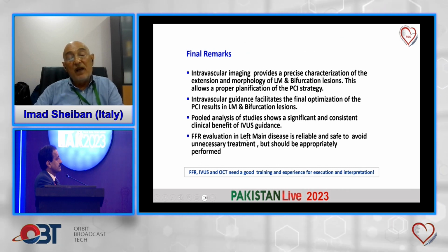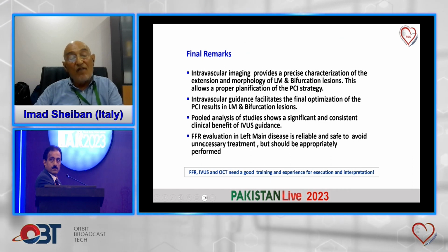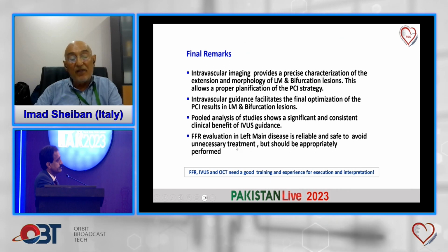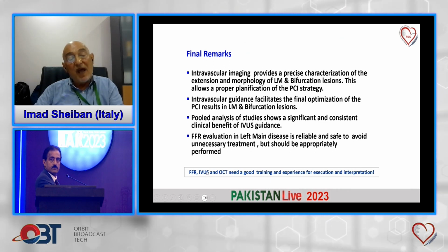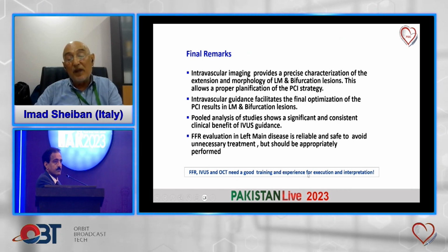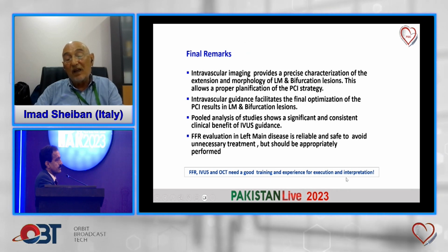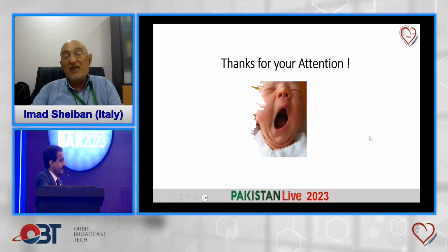FFR evaluation in left main disease is reliable and safe to avoid unnecessary treatment, but should be appropriately performed. I think both physiology and intravascular imaging need good training and good experience for execution and, most importantly, for interpretation. Thank you very much for your attention.